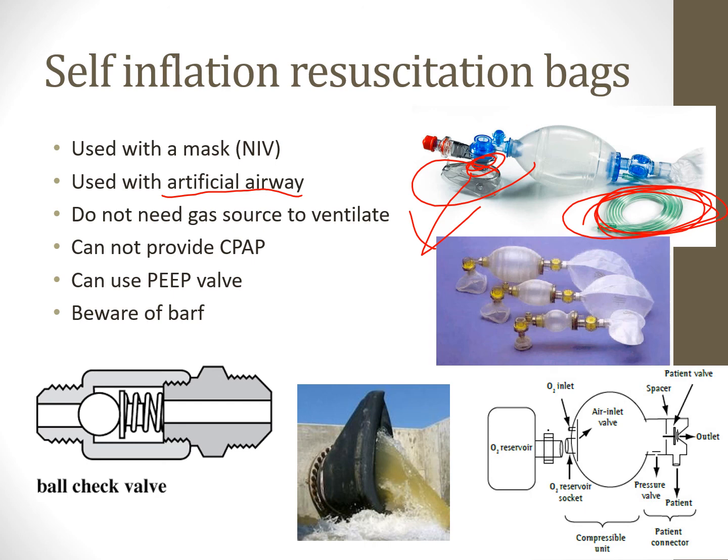It self-inflates. The big thing here is it cannot provide continuous airway pressure, right? If I squeeze the bag, gas will go into their body, whether they're non-invasively or invasively ventilated, and then it will close this little duckbill thing that's in there, so it won't allow it to give continuous pressure. So understand, if we need to provide CPAP, we cannot use a self-inflation bag. We have to use a flow inflation bag if we want to provide CPAP.